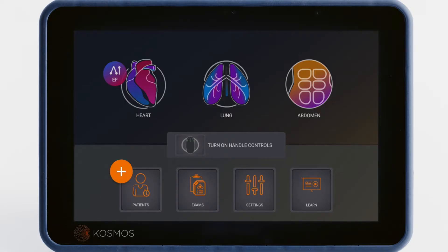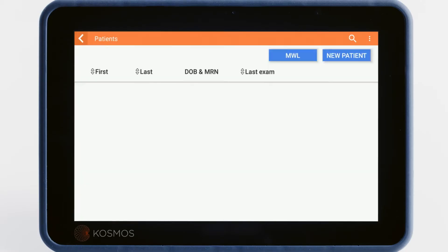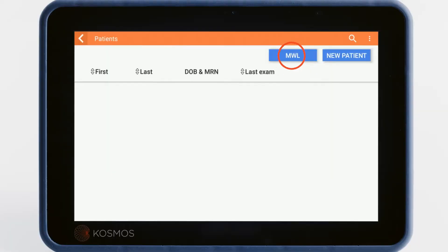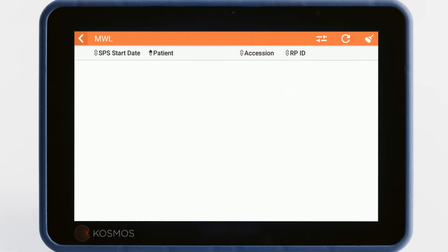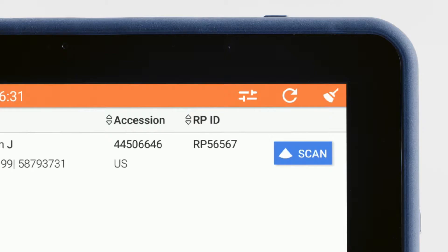On the home screen, tap the Patients icon to view a list of existing patients. If your facility has connected Cosmos to its Healthcare Information Management System, you may easily access patient information by tapping on the Modality Worklist button. The Modality Worklist will bring up a list of patients that have been assigned to your station for exams today. Tap the Refresh button to access the most up-to-date list.